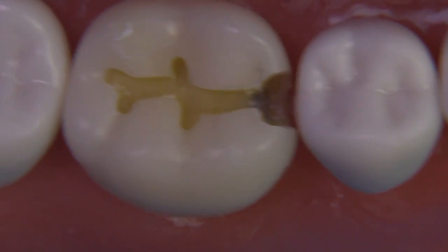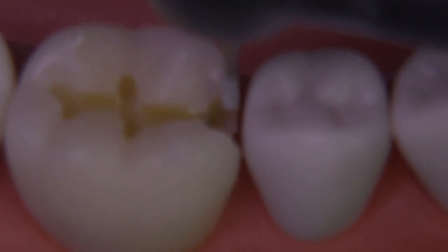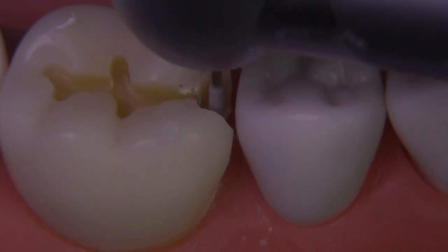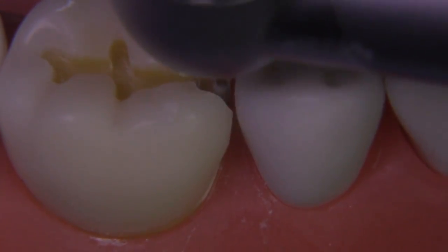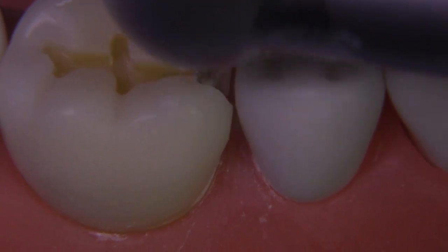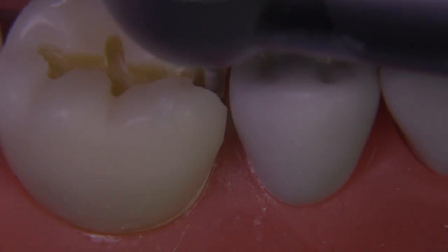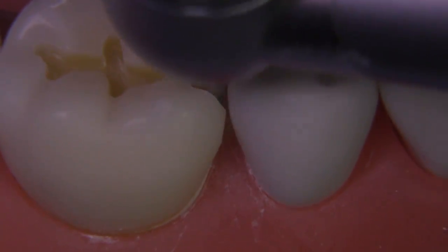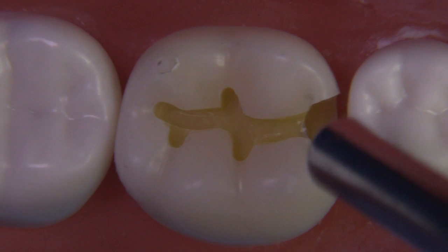I think I was able to recover because the decay did extend significantly gingivally and we ended up with a preparation that would meet the standards of the examination. Be mindful of the adjacent tooth — one of the reasons for failing any examination would be nicking the adjacent tooth, and the other would be leaving undermined enamel or leaving caries behind.